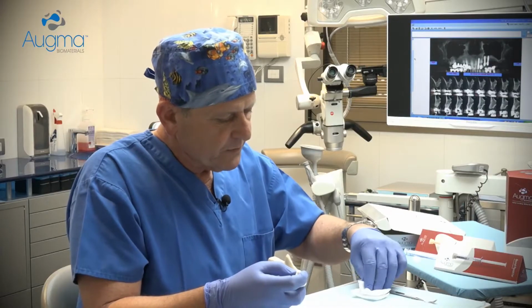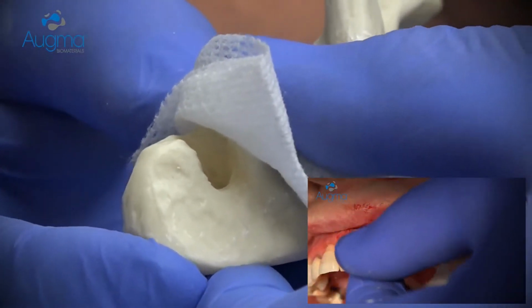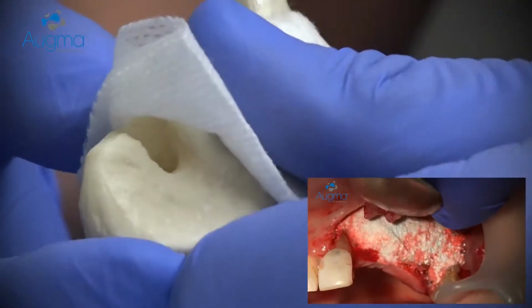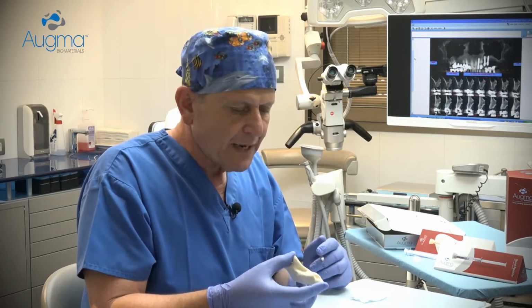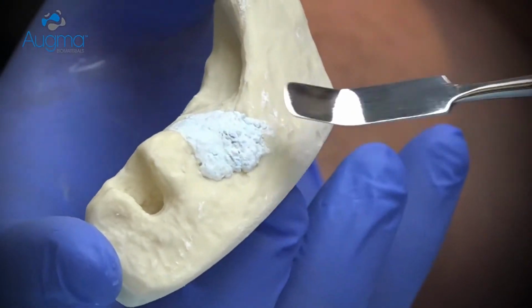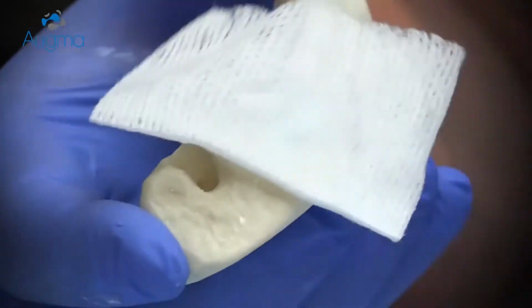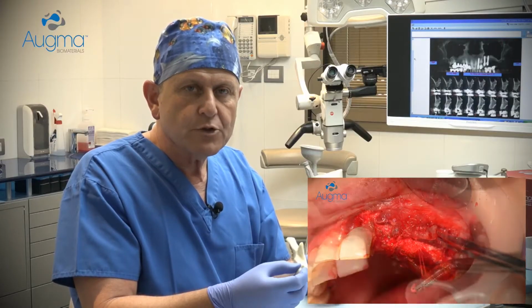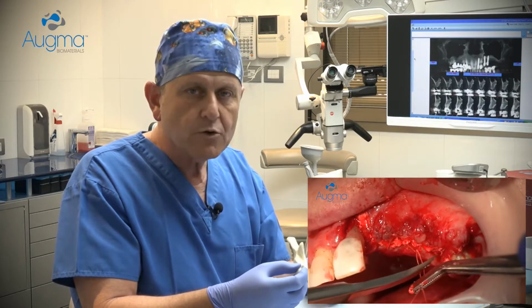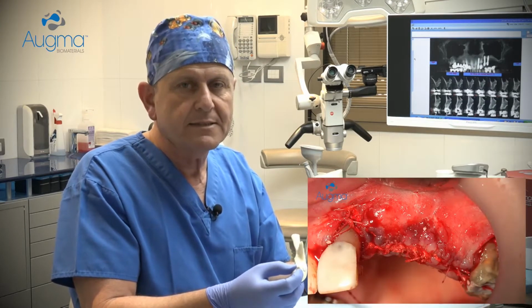At this stage, you should take a dry gauze, place it above the cement and press it firmly for 3 seconds. Now the material is already well stabilized. If you need to shape, you can shape it a little bit and press it again for 3 seconds and you can close the flap. However, it's very important that your soft tissue will be primarily closed and well sutured. That's all, simple as that.